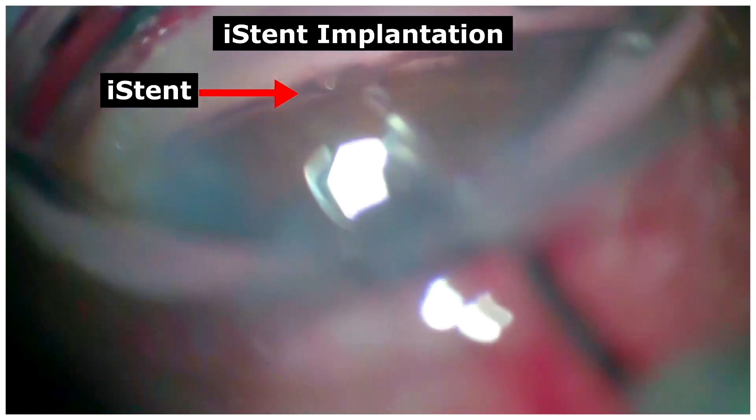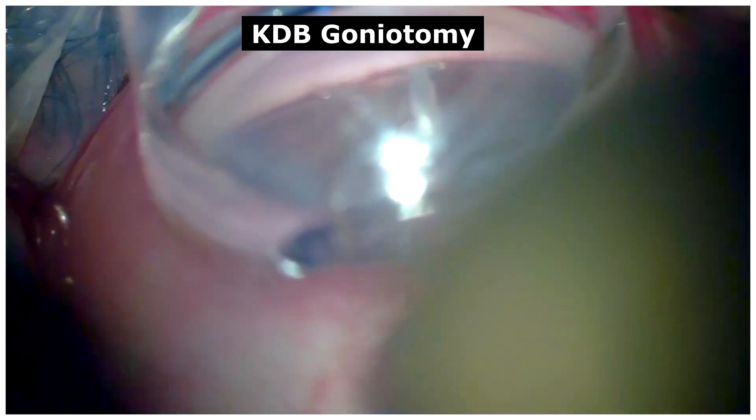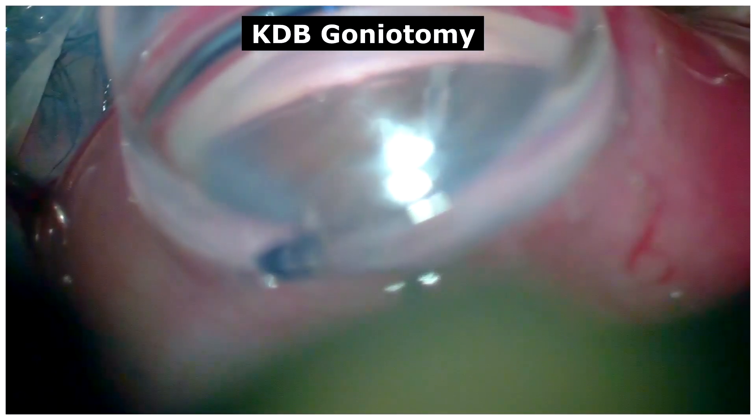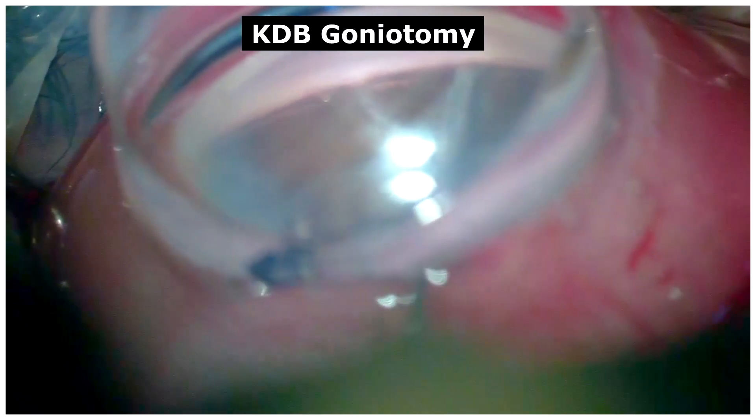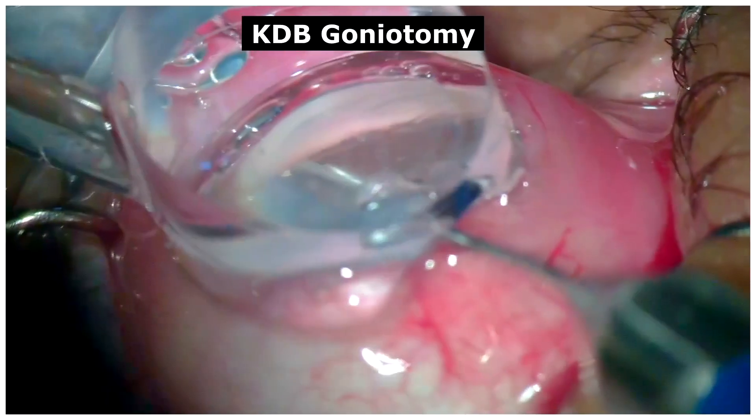Following which, an additional MIGS procedure was performed — the Kahook Dual Blade goniotomy — on either side of the implantation at least one to two clock hours apart, to increase the outflow via the trabecular meshwork.